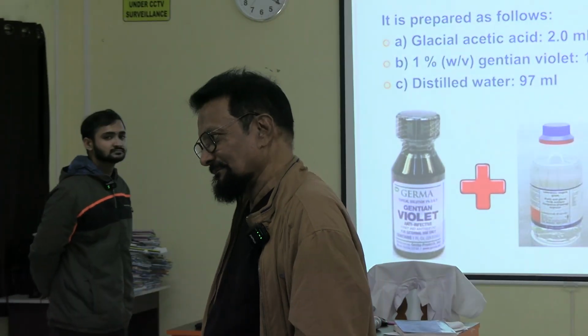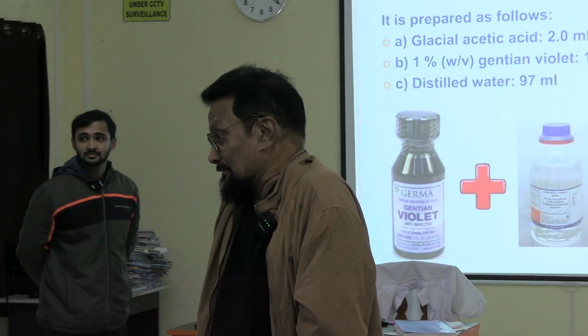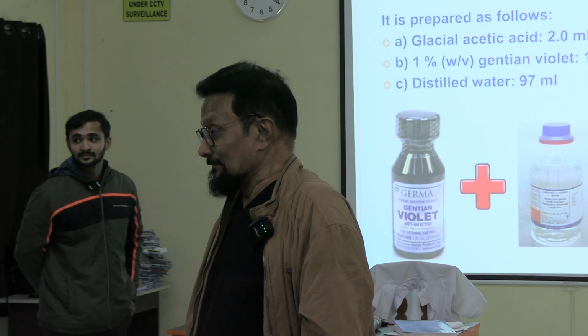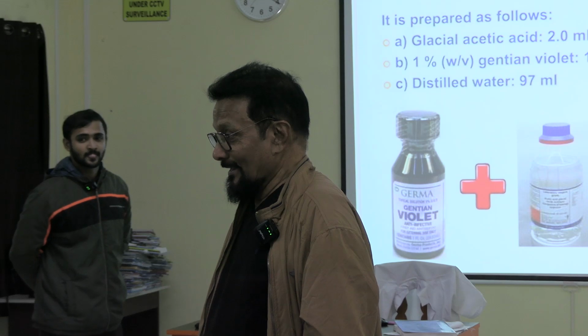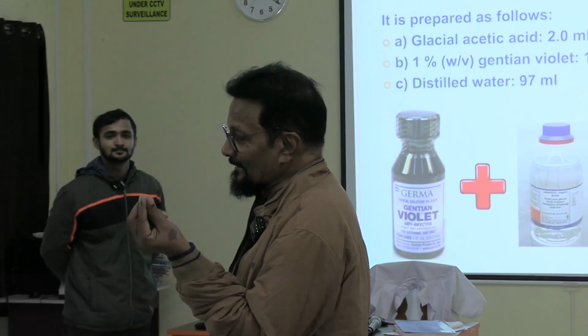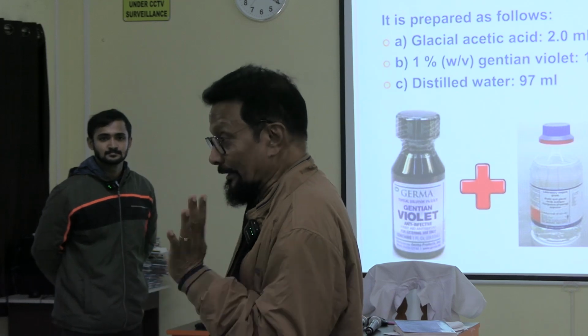It can. The WBCs have no mechanism to prevent acetic acid from lysing the membrane. So there will be lysis, and the nucleus will become exposed. The nucleus will not go away.